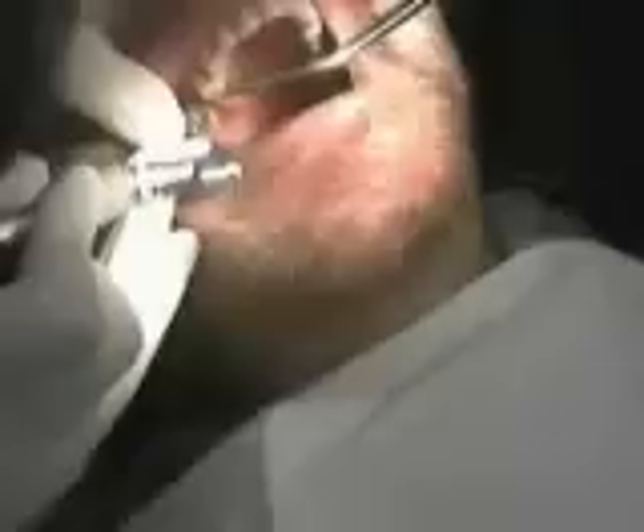Instead of using tremendous trauma to continue penetrating, we're going to use a micro diamond. We're going to enlarge the hole from two millimeters to 2.8 millimeters so that we have enough room to insert a round diamond bur and slowly erode away the floor of the sinus, so that it does not require too much trauma to elevate the sinus membrane. We're continuing our drilling sequence until we're at 2.8 millimeters in diameter down to the previous depth stop.